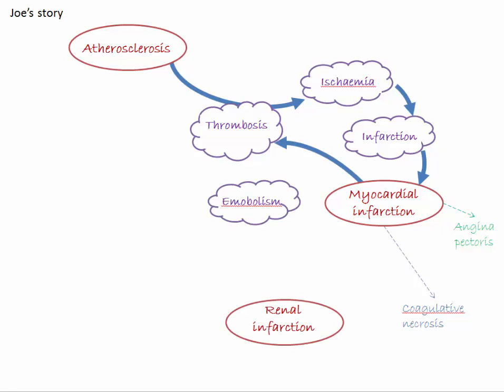The next slide we saw was that of a renal infarct. And we talked for some time about how that could have arisen, and we realized eventually that the issue here was that there was thrombosis, that same process, occurring on the left ventricular endocardial surface, a mural thrombus. That was a complication of myocardial infarction, and that had embolized a thromboembolus in the systemic arterial system that had lodged in a branch of the renal artery on one side and produced again a localized area of ischemic necrosis called a renal infarct.